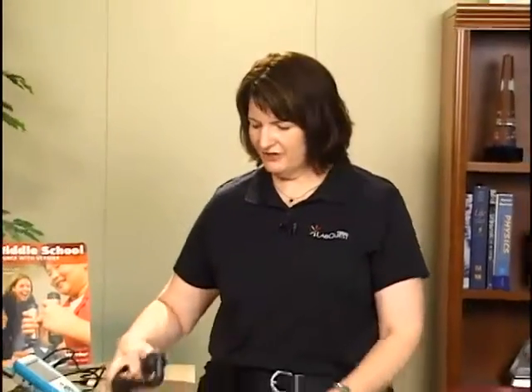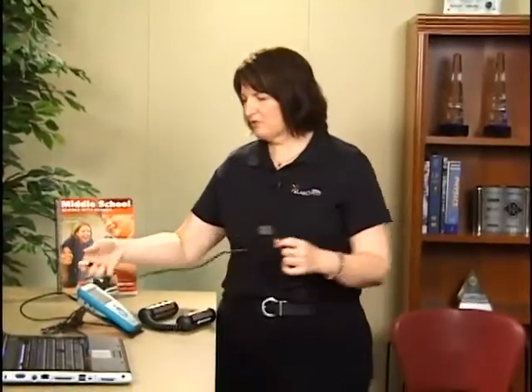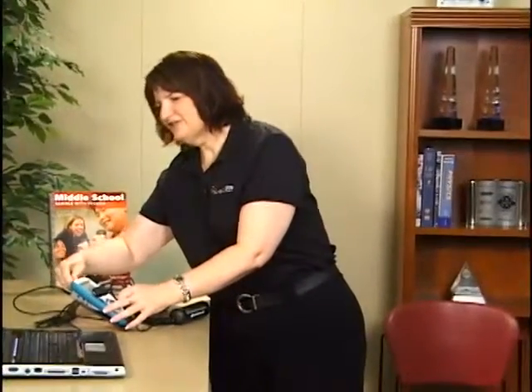This experiment is called Heart Rate and Body Position. It's Experiment 25 from the Middle School with Vernier Lab Manual. It's going to be using a hand grip heart rate monitor. These are the hand grips here, and then this is the receiver. We're going to plug the receiver into LabQuest, using that as an interface to go into the computer with LoggerLite software.